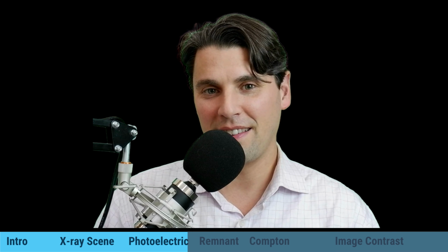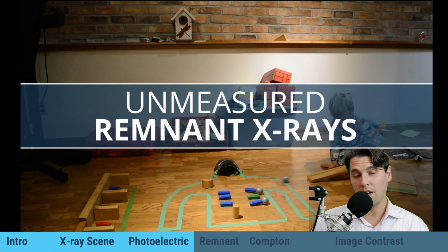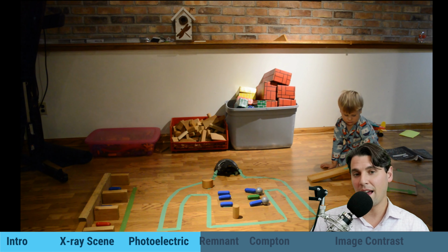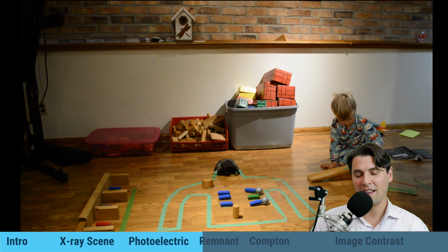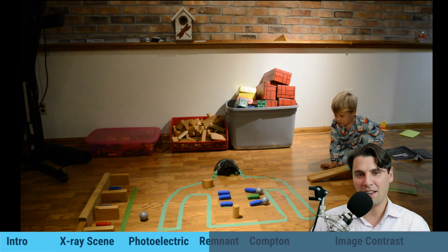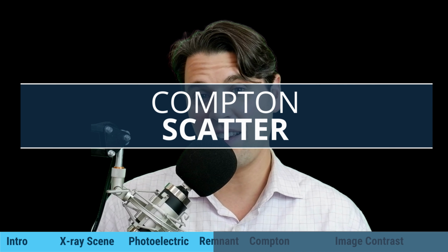We'll also show one thing that happened, which really does happen in real acquisitions as well: the case where an X-ray could pass all the way through and hit the anti-scatter grid, or hit an area of the detector which is not an active area. In this case, it would not be a measured X-ray photon. That's a case that we saw in this example, and it is something that can happen in reality as well. Then we'll also show the case of X-ray scattering.